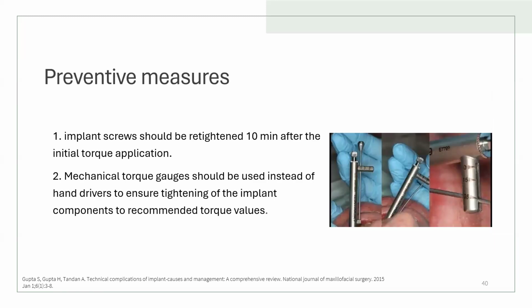Okay, now we will talk about preventive measures to avoid the incidence of screw loosening of implant restorations.